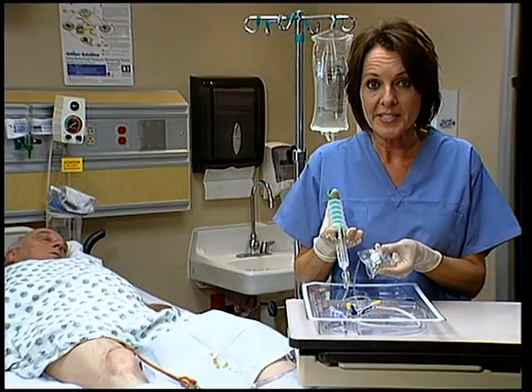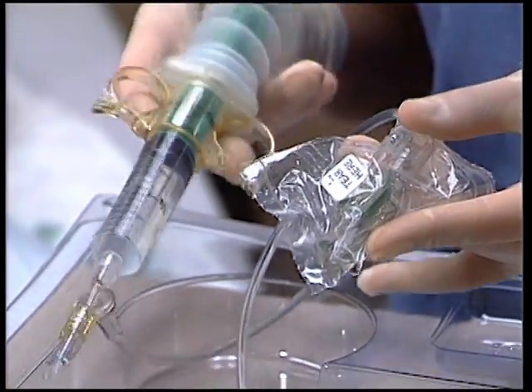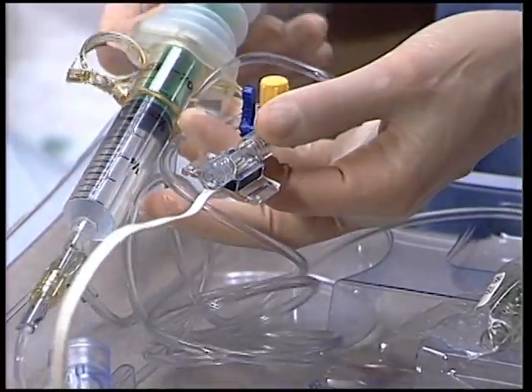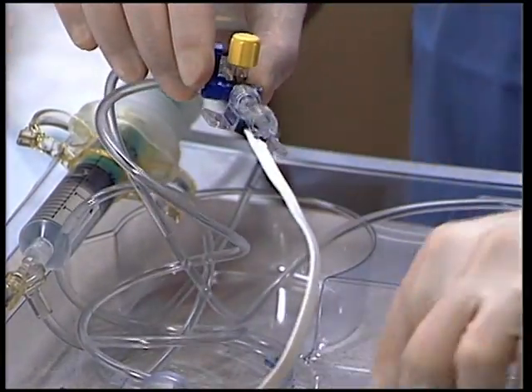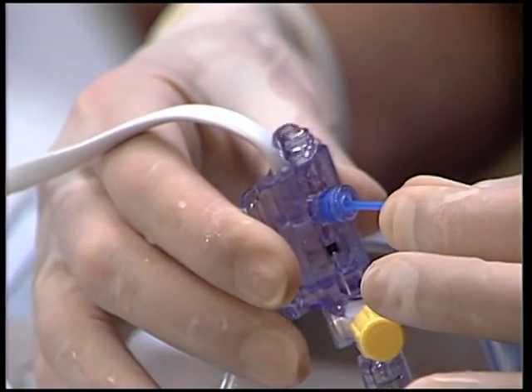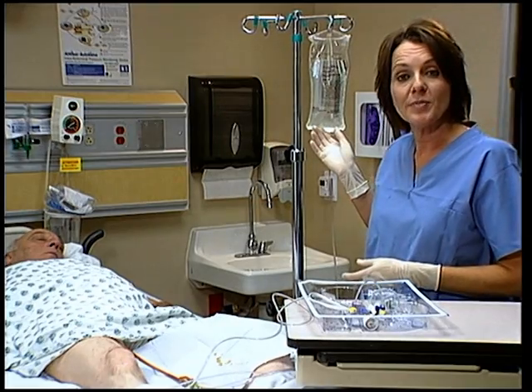Aspirate saline and flush air from the system. Stop injecting saline once it is running out of the tip of the AbVisor valve and all the bubbles are cleared from the tubing. Flush the transducer by opening the cap and continuing to inject saline until it runs out of the end of the transducer, then cap the end with the yellow cap provided. If using a transducer with a permanently attached flush device, activate the flush device to allow saline to flow through the transducer and cap it as well. Note that no pressure bag is required for intra-abdominal pressure monitoring.